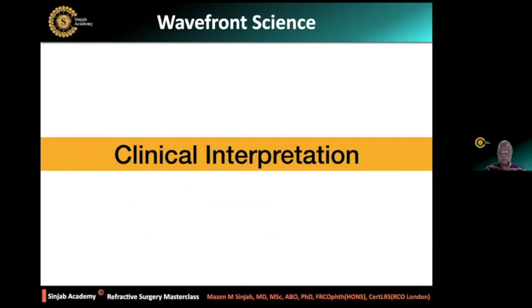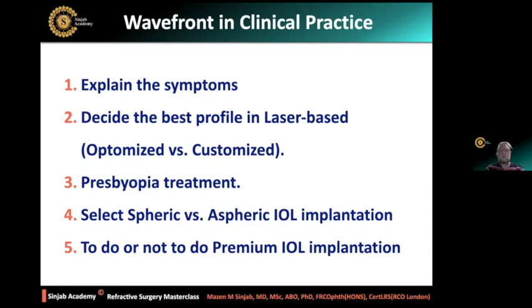I will show you some of the clinical interpretation of the wavefront. Of course, why we should study wavefront of every patient coming for refractive surgery, because we can explain the symptoms, we can know what symptoms he has. We can decide the best profile in laser-based refractive surgery, whether it is optimized, the usual one, or customized, wavefront guided or topography guided.